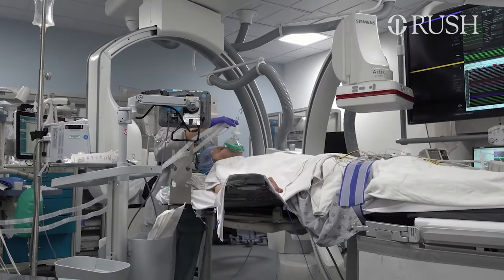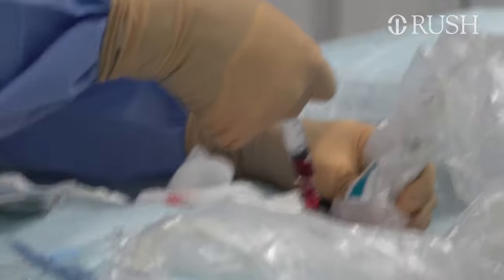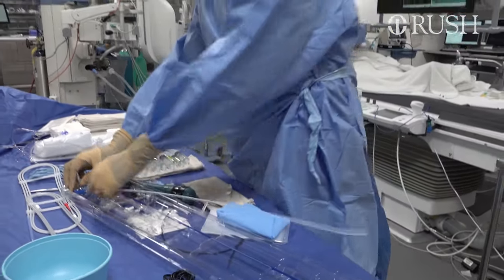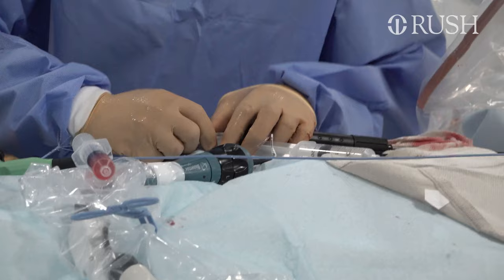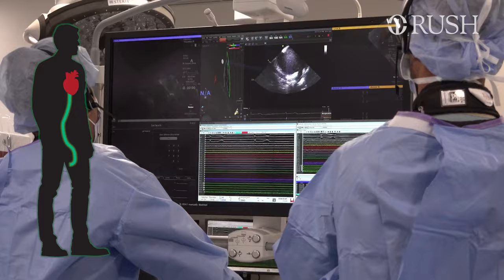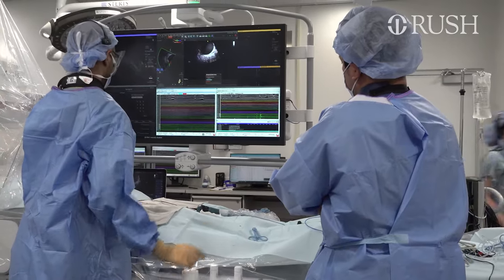The patient is sedated. So right now we're getting access to the femoral vein using a syringe. Once we get access to the vein, we'll pass a wire. Everything's done over a soft wire, because we don't want anything sharp ever to hit the wall of the heart. They're essentially tubes that are a conduit to allow us to make our way into the heart. About to enter the heart, there you have a live image of the heart, and he'll look at the left atrium, which is the chamber where we're gonna do our work.